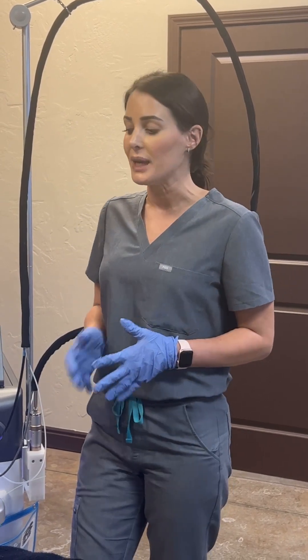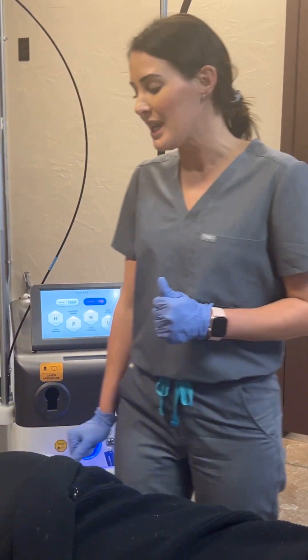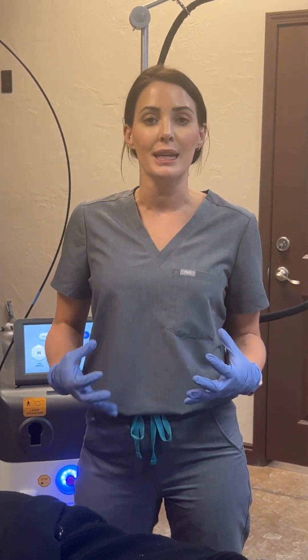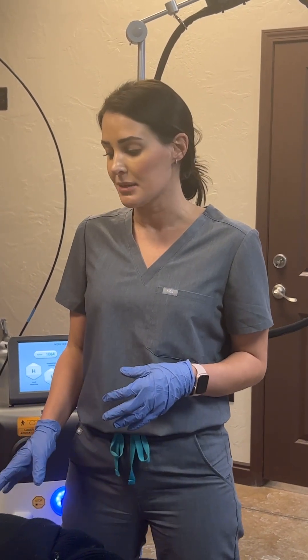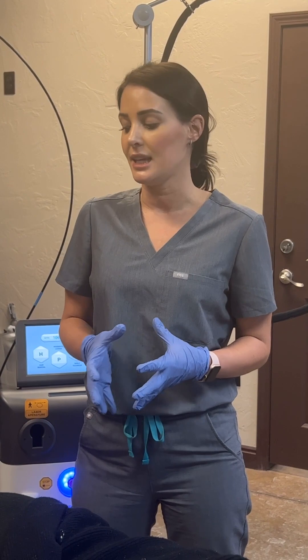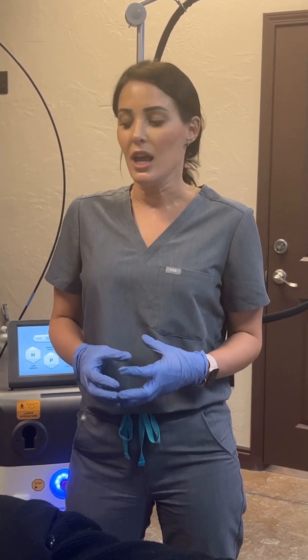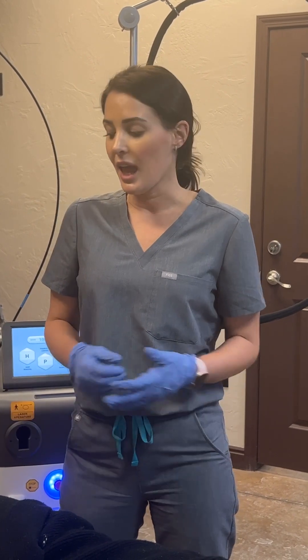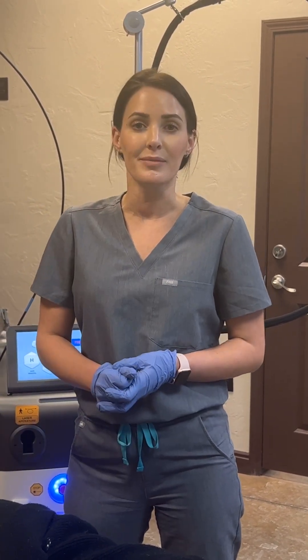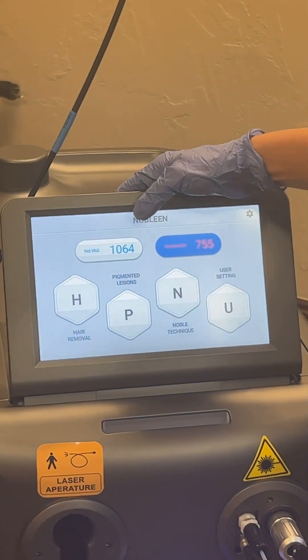So we are going to do another treatment — the fractional handpiece. What we're doing is we're going to brighten up her skin. She does have melasma, a little bit of redness, and her skin is going to brighten up and that pigment is going to lighten up. You don't need numbing cream, and with multiple passes all she's going to feel is warmth. For the fractional, you can do the 755 or also the 1064.